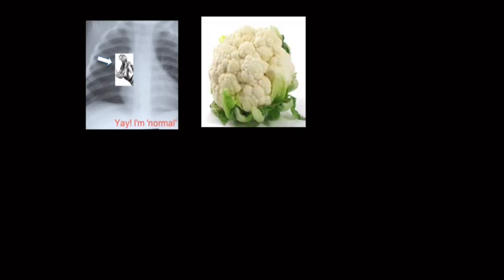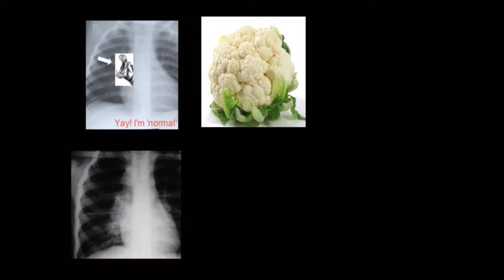So let's look at TB on the frontal chest radiograph. The hilum should look like the open mouth of a hippopotamus; if there's lymphadenopathy we say it looks like a cauliflower or a mass. Here's the normal again — the arrow shows a normal hilum with diverging vessels, the open mouth of a hippopotamus. And there's a picture of a cauliflower for reference. In the bottom left-hand corner, exactly where the arrow is, you can see a big lumpy mass replacing the open mouth of the hippopotamus — those are obvious lymph nodes.